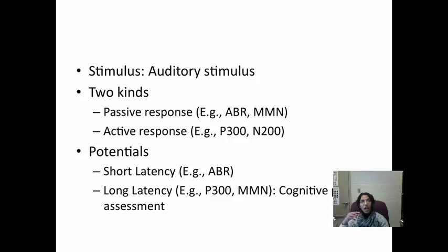Now, for event-related potential, most of the time the stimulus is an auditory stimulus, meaning you're hearing something. Some of the studies they've done are visual event-related potentials, but I will not go into that for now. All I want you to understand is most of the time the stimulus that you present to understand an event-related potential is the auditory stimulus.